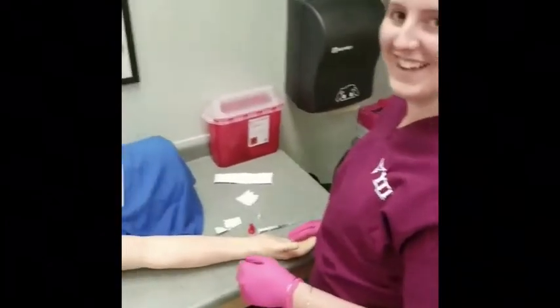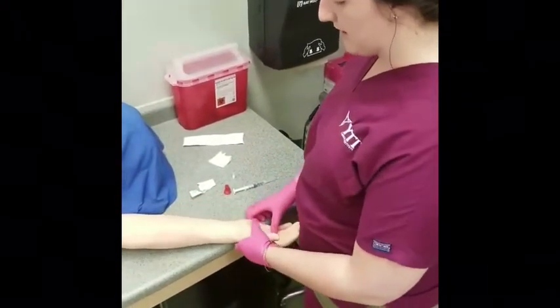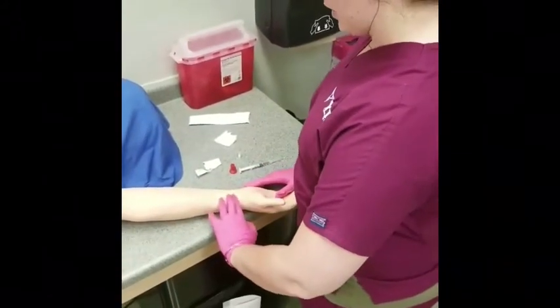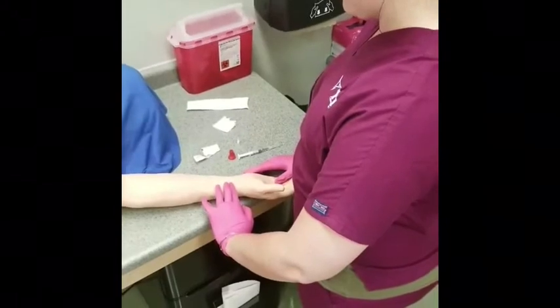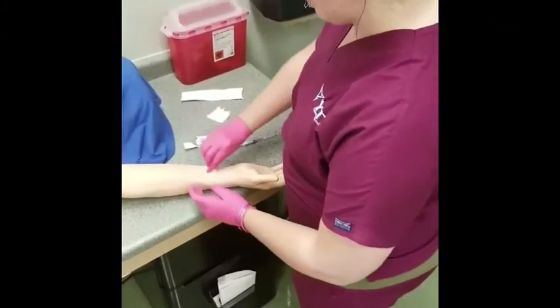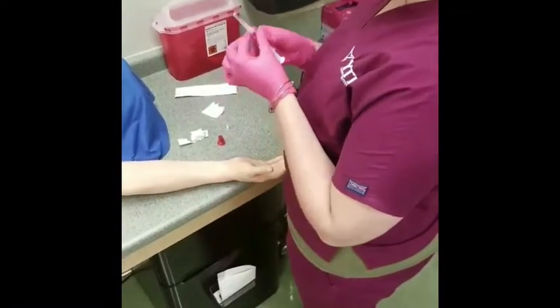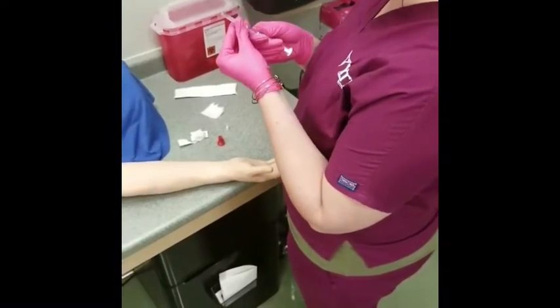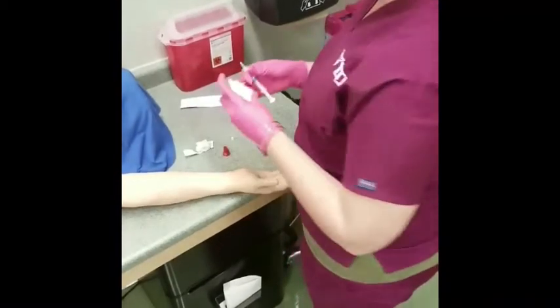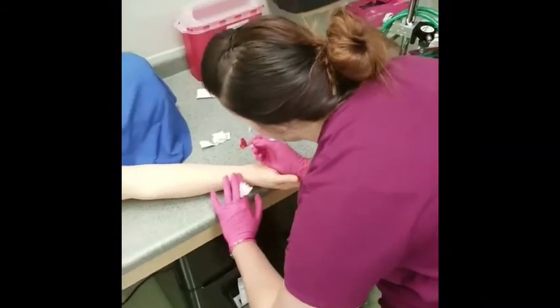Alrighty, for an ABG, you want to get the arm set up. Sometimes you can use a towel to overextend it, but here we're good. First, you want to feel for the pulse. Once you find where you want to puncture, you're going to take your alcohol swab and clean it off. You're going to get your needle ready. Make sure it's on, bubbles up. You're going to want your gauze pad right next to you. And then you're going to feel for your pulse again.